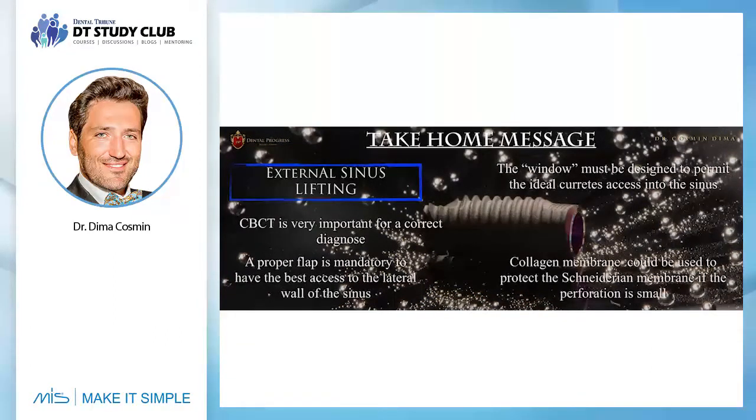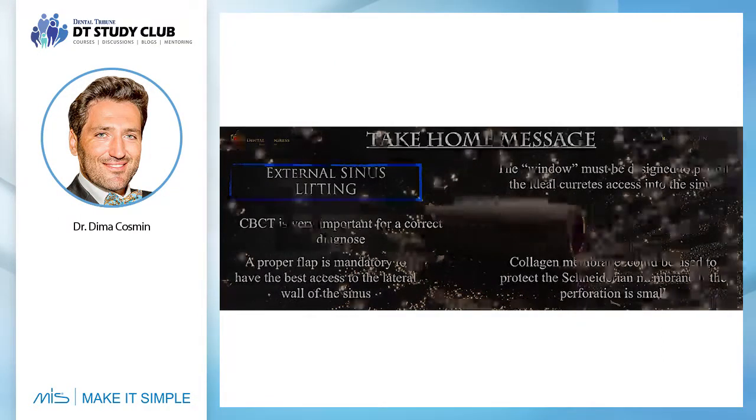And don't forget, never push the membrane, just keep the curettes in contact with the bone. Don't push the membrane because you will perforate it. And of course, the collagen membrane could be used to protect the Schneiderian membrane if the perforation is small.